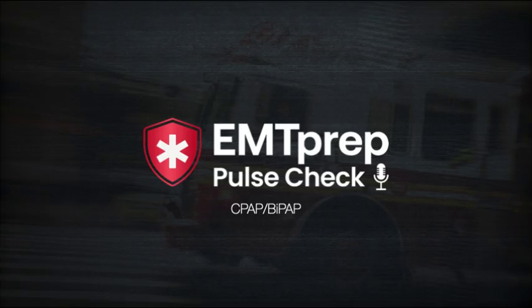Question number 9. Why is BiPAP preferred over CPAP in asthma and COPD patients? A, BiPAP allows the patient to exhale against a lower pressure, helping improve ventilation efforts. B, BiPAP is preferred because it maintains continuous positive airway pressure. C, BiPAP is not preferred and should not be used in these patients. D, BiPAP allows for the use of duoneb in conjunction with BiPAP.